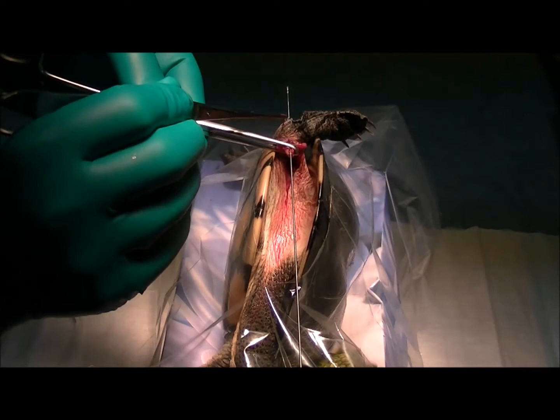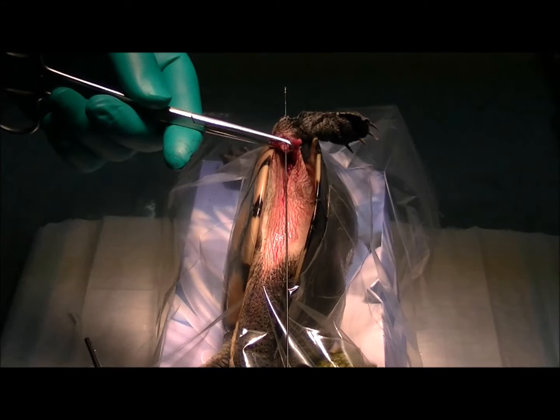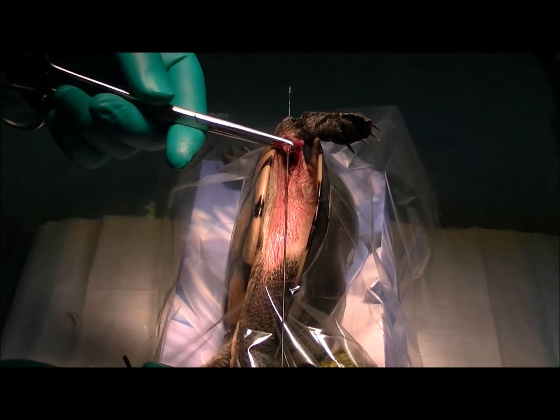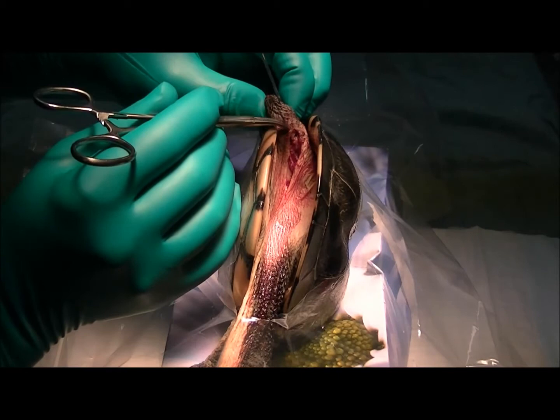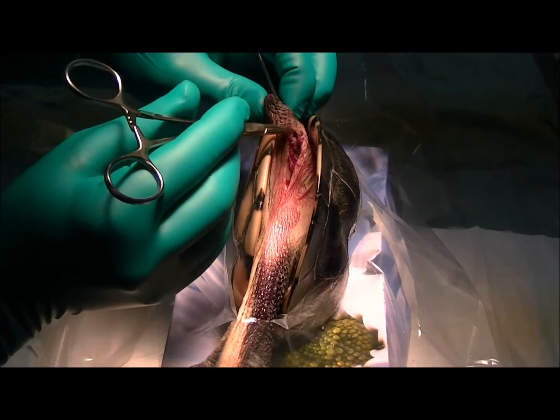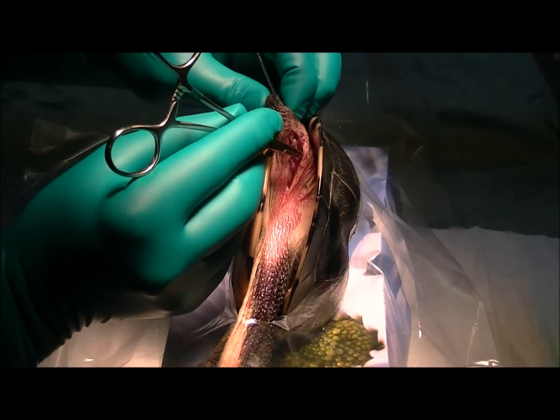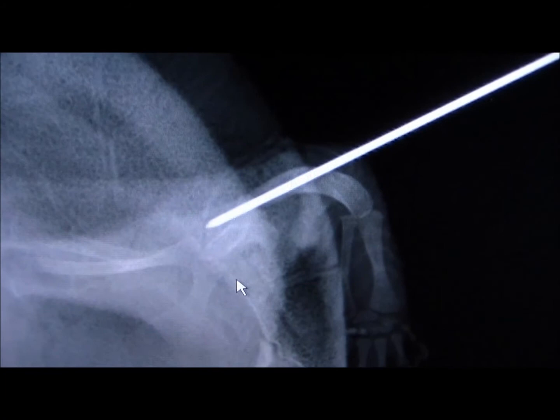Step one: I've put that wire down the middle of that bone and driven it out through the skin on the other side. I'm going to pull that pin as far out as I can, line it up the other way, and drill back down into the upper fragment. This is called retrograde pinning. Hopefully that will get that bone all nicely lined up. We managed to get the pin through — it's passing up through the humerus, through the fracture, and coming out further up the fragment. It's actually quite stable, so I'm quite happy with the stability.